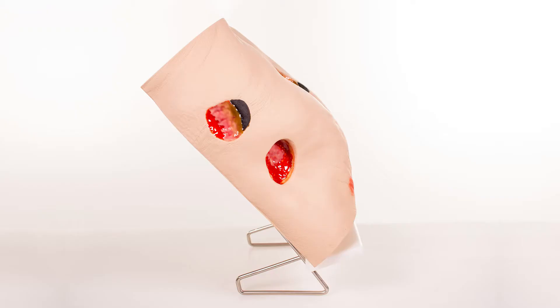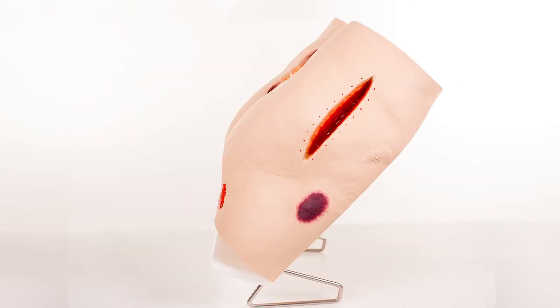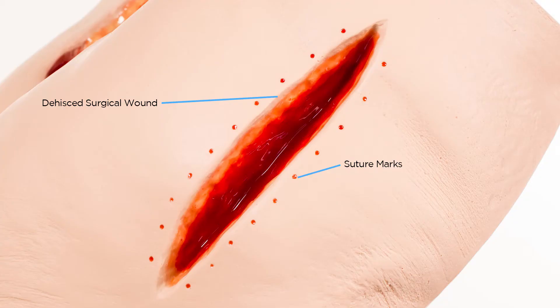The left side of the model shows an unstageable wound as the wound bed is not visible. On the right side of the model, you have a DTI with a dehiscent wound where you can see the small red dots left from the sutures.